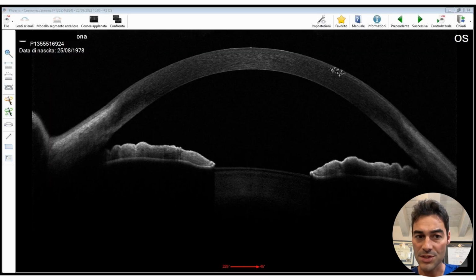So, of course, we tried to measure everything. We measured with ultrasound technology and also with OCT technology, which is very convenient and reliable. And especially we went, as you can see here, to the periphery of the flap because the vast majority of the epithelial remodeling after a hyperopic case happens in the periphery, since the hyperopic treatment is peripheral.